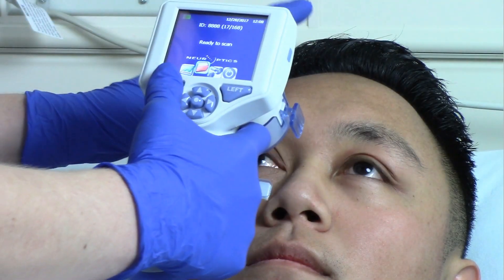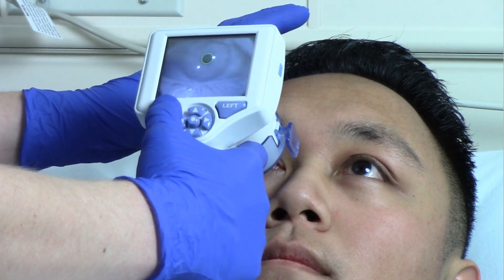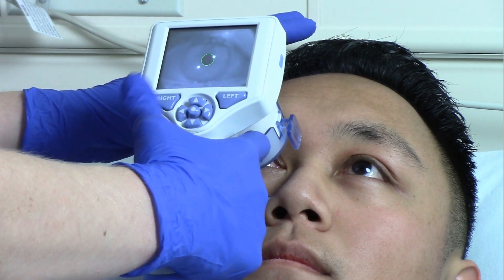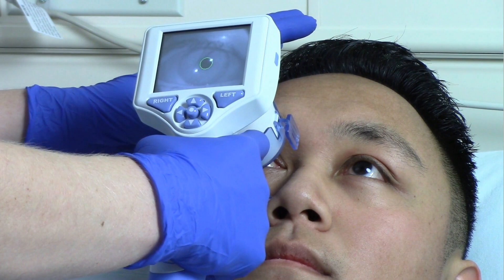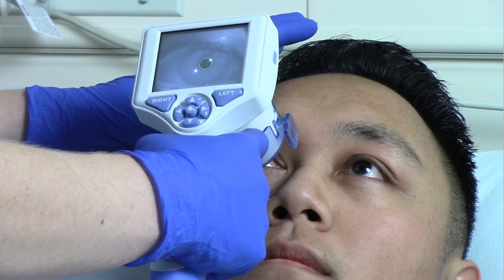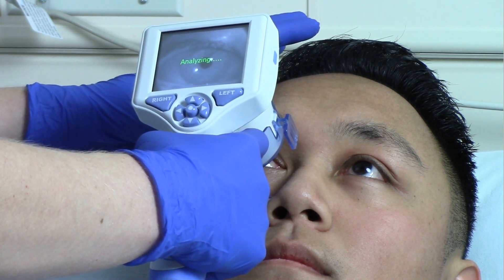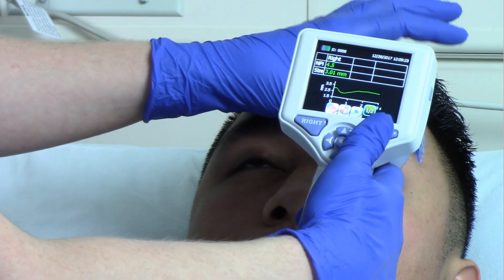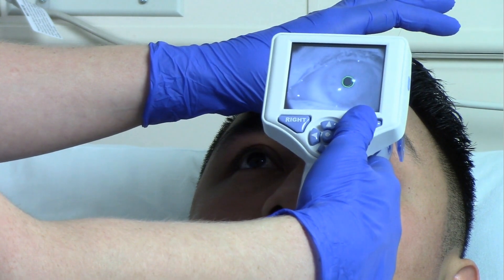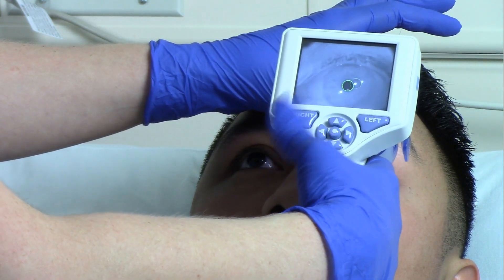Press and hold either the right or left button until the eye is centered on the touch screen and the display shows a green circle around the pupil. Once the green circle appears, release the button and hold the NPI 200 in place for approximately 3 seconds until the result screen is displayed. Repeat the measurement for the patient's other eye to complete the bilateral pupil exam.